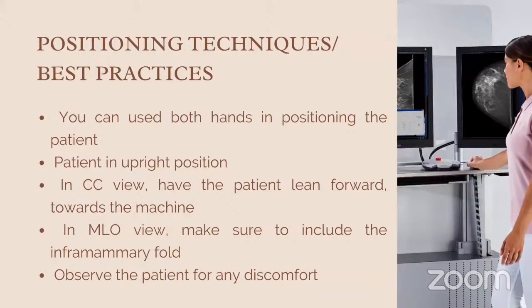Next and last one, observe the patient for any discomfort and check if you can eliminate or lessen the discomfort of the patient to avoid any motion that can lead to artifact, as well as to provide comfort to the patient and lessen their anxiety.